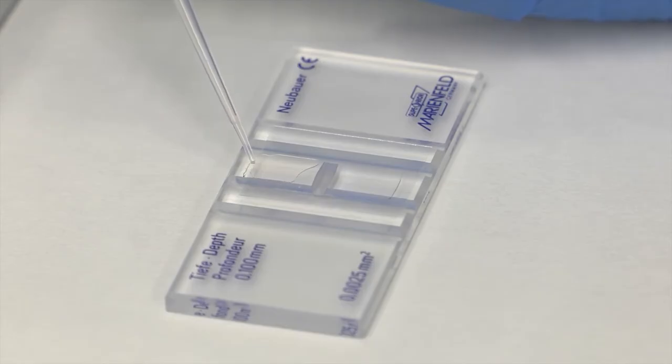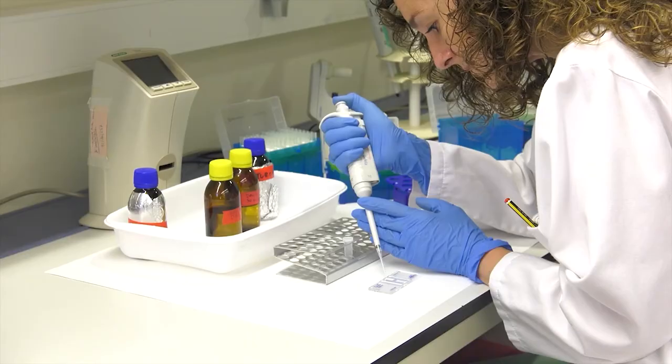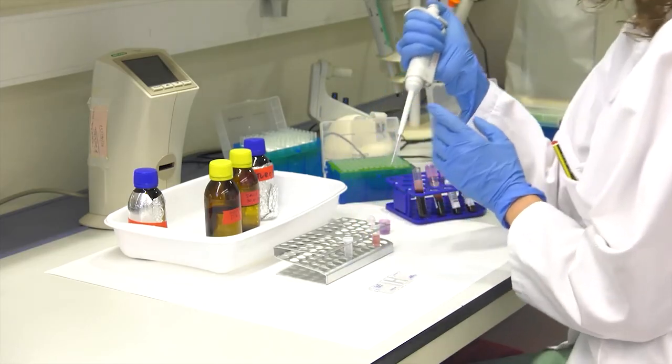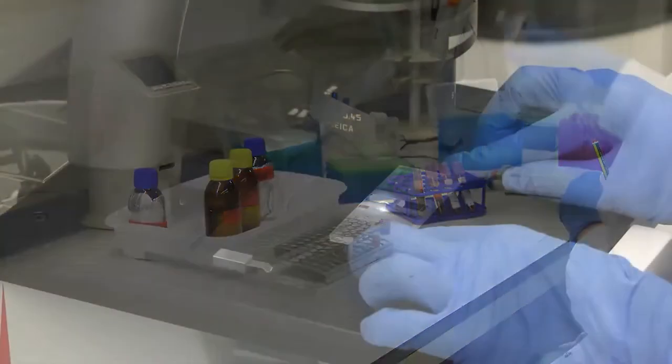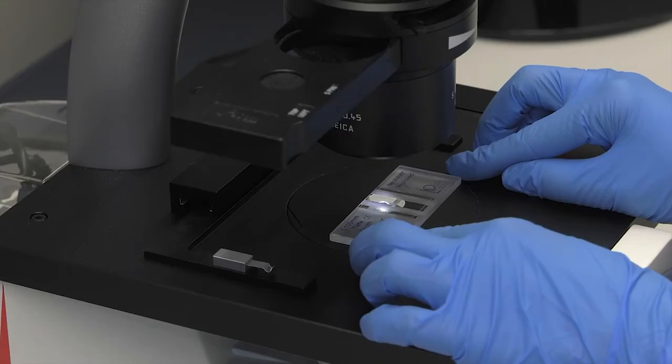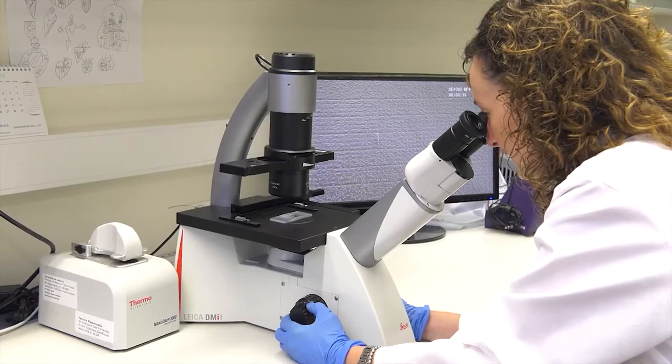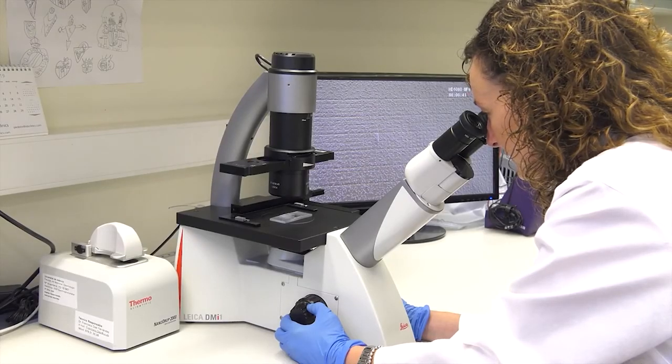It is advisable to maintain a certain inclination between the pipette tip and the chamber to facilitate capillary entry of the sample. Once the sample has been deposited in the chamber, we can observe it under the microscope, starting with the 4x magnification objective to locate and focus on the central grid and to check that the distribution of cells is homogeneous.